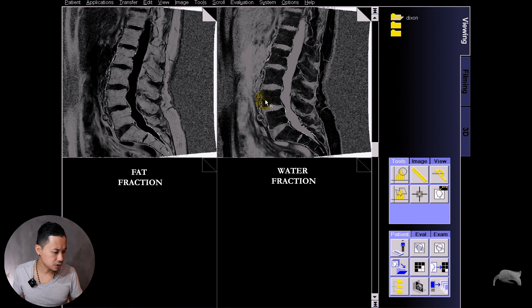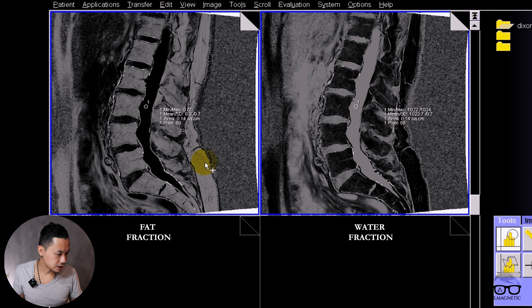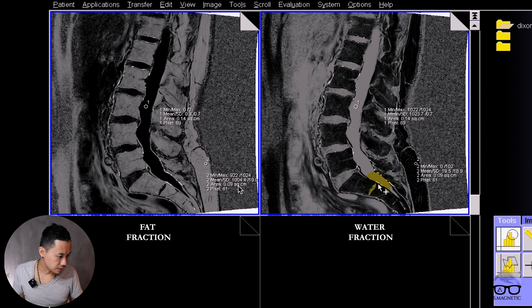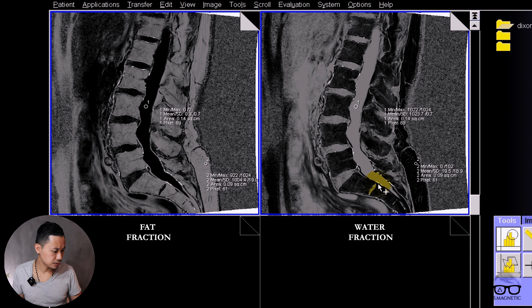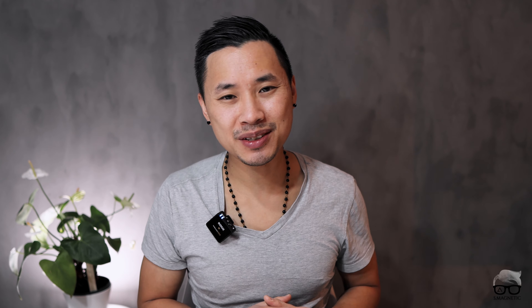Now we're going to mark these two and drag them to the viewer, and I'll show you the differences between fat and water. This is fat percentage, this is water — CSF is bright and the fat is dark, so it's opposite. Let's check it with a region of interest: there's a lot of water there, not much fat — correct. And down here, it's fat, so there's not much water in there, just a little bit.